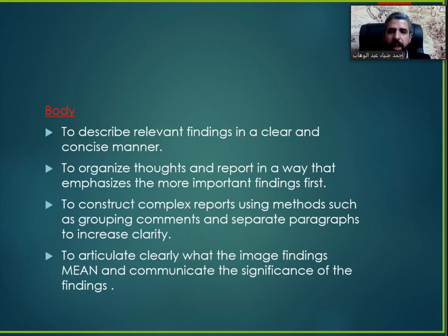So the findings should be described in a clear and concise manner, and you should organize your ideas in the report in a way that emphasizes more important findings first. We start with the more important findings, and then we go to the less important findings. And to construct a complex report, use methods such as grouping comments and separate paragraphs to increase clarity. We put each paragraph separate from the previous one to make it more clear.